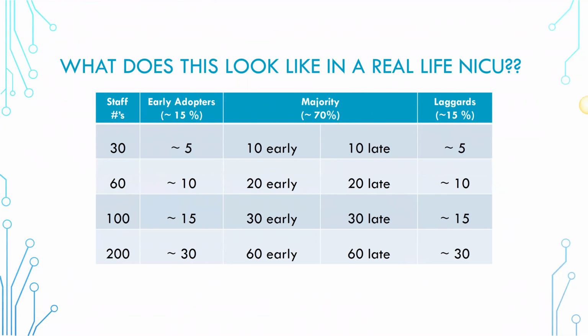But what we did at Stanford when we first started up is we honestly tracked our babies. We printed out a census every Monday, I think for 4 or 6 weeks. And we went through the unit and did 2 things. If we had all of the devices that we'd ordered and if we had our neuro-NICU running, would we admit this baby to the neuro-NICU today, and would he be on a monitor? So going through our unit census, we could see, of all the babies we had, if we could have, would we have monitored? If we could have, would we have admitted to the neuro-NICU that day?